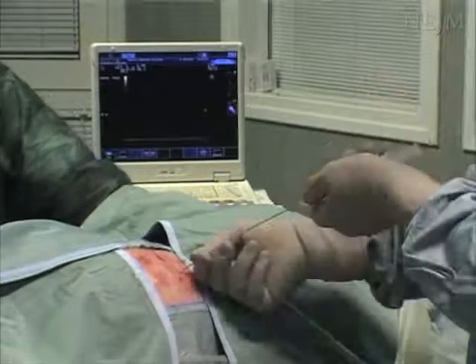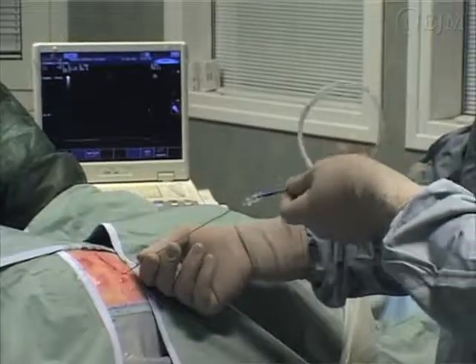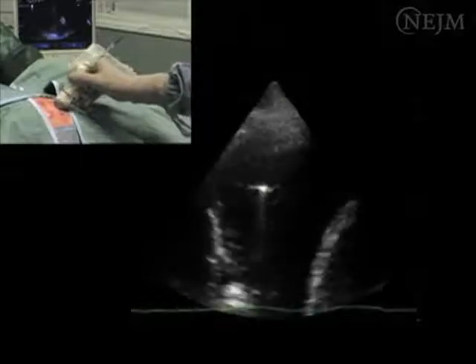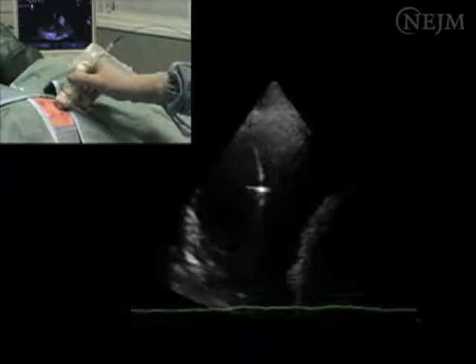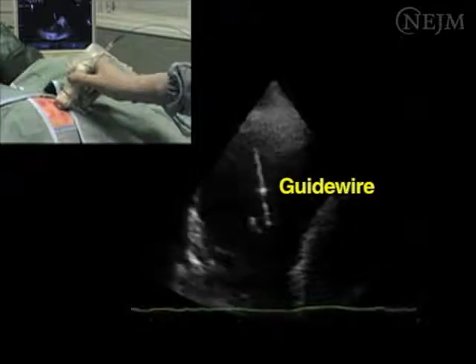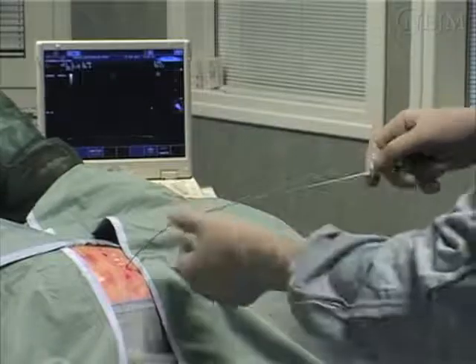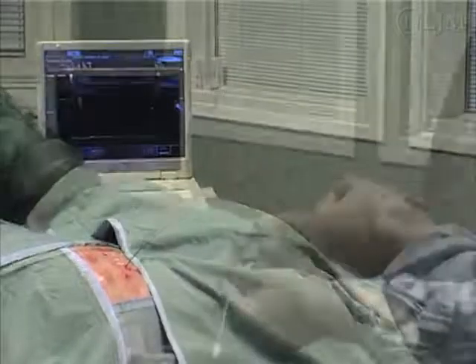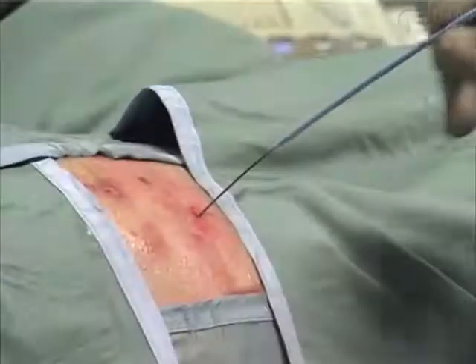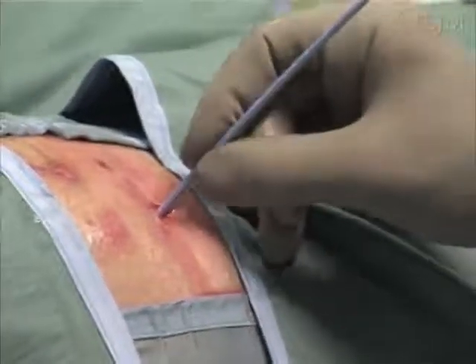Confirm the penetration of the needle into the pleural space by aspirating pleural fluid into the syringe. Once you have reached the pleural space, disconnect the syringe and slide the guide wire through the needle into the pleural space. Confirm the intrapleural location of the wire as you visualize it with the ultrasound unit. Remove the needle and advance the dilator over the wire by its half through the skin and the parietal structures, pushing it firmly but gently against the skin, twisting it as it advances.